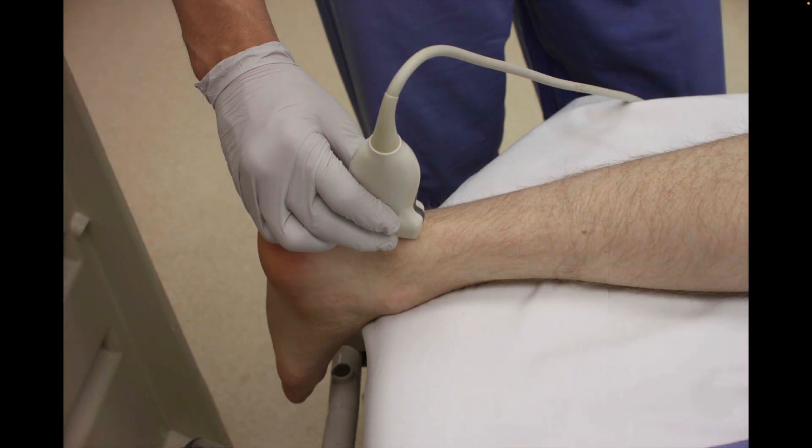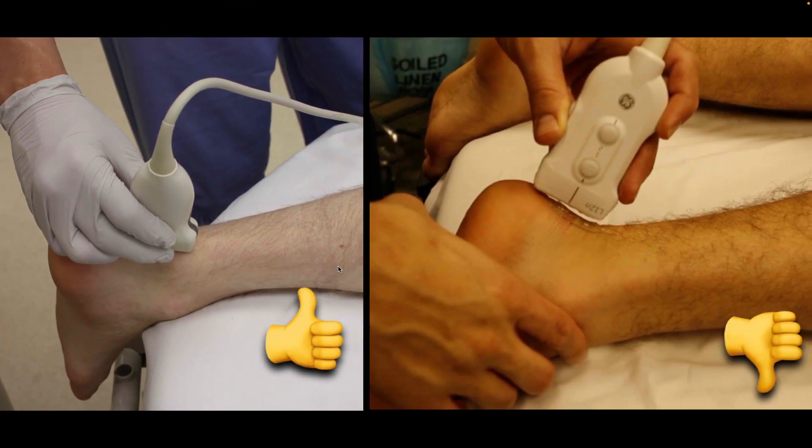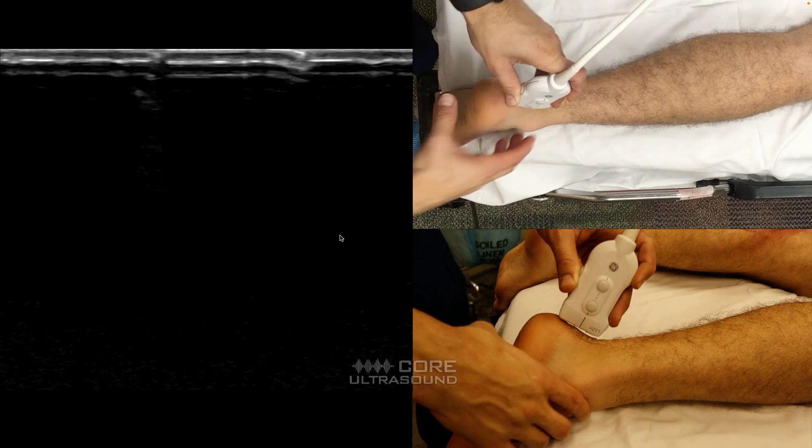When you are performing this examination, if you can have the foot hang over the edge of the bed, it's probably a bit better. If you have the patient prone with her feet still on the bed, the foot is going to create a little curve, making it harder to get a nice view of that calcaneal tendon. Whereas if you have the foot essentially dorsiflexed, that's going to be nice and straight and make it a lot easier for you to see.